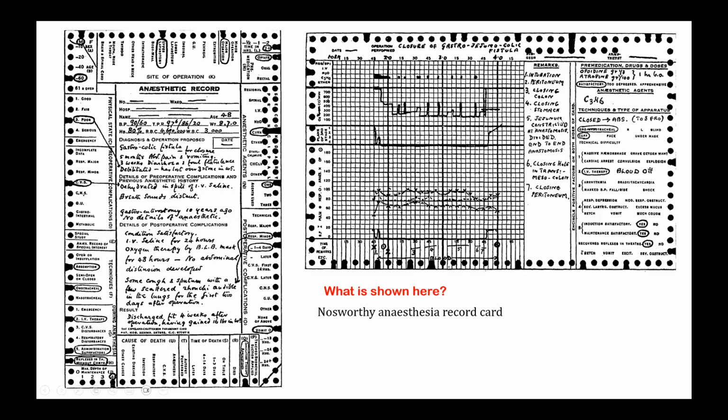And this is the intraoperative monitoring. And you always put the time. Starting time is 10 a.m. and goes on till 4 p.m. And these are all the BP recordings. You can see systolic is marked by a downward arrow and diastolic by an upward arrow, and they are connected. They are monitoring every 10 minutes or 15 minutes. You can mark the time, and what are all the drugs that have been administered, how much of inhalation agents given, and all these things. And here you find a chemical symbol, C3H6. What drug has been used?